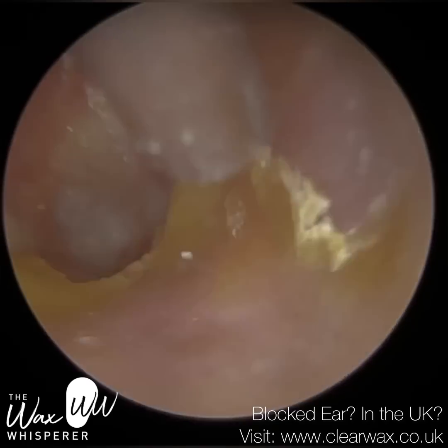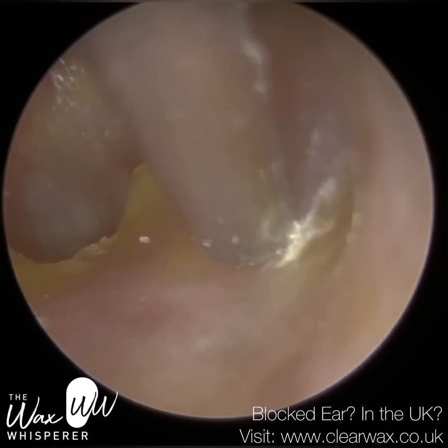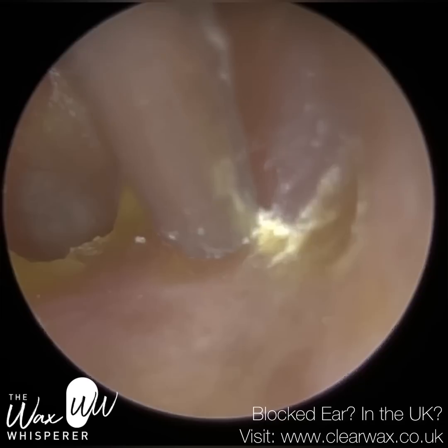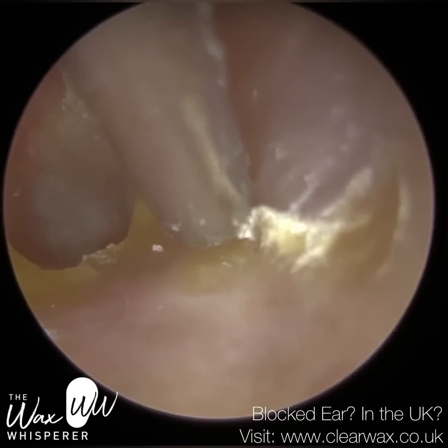The fogging is due to the patient's otitis externa. So when there's an infection, your body's response is to have inflammation, which then increases the temperature in an attempt to fight off the infection, and that can cause condensation on the lens of the endoscope.